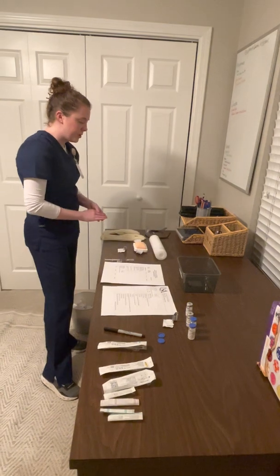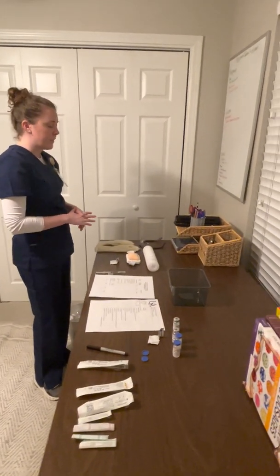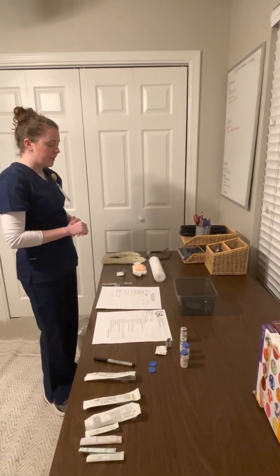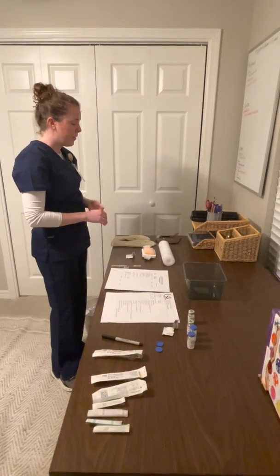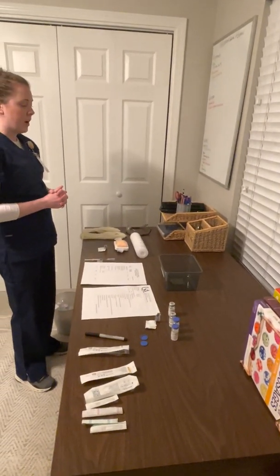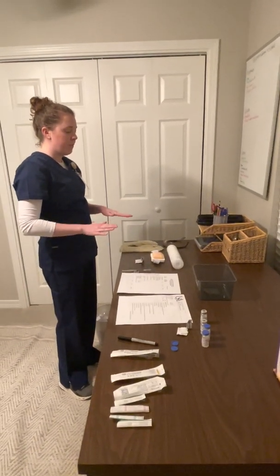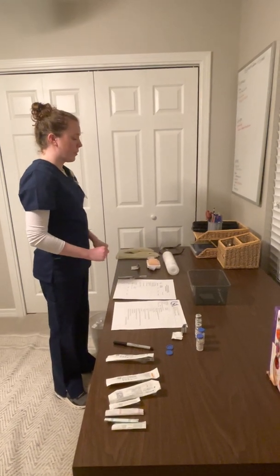So the next thing I would do is come over to the patient and explain the procedure to the patient. I would let him know that he is getting a subcutaneous injection of heparin, and that if he has any discomfort or any questions, just to let me know. Then I would go ahead and raise the patient to a working height. So I would raise the bed up above my waist. Today it's not above my waist, but in a clinical setting it would be. And I would lower the bed rail.